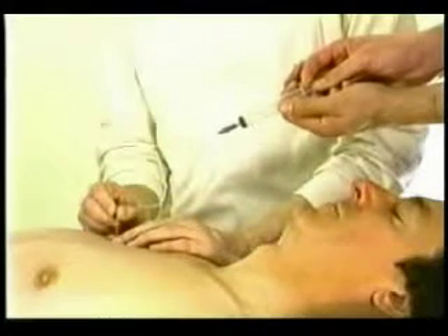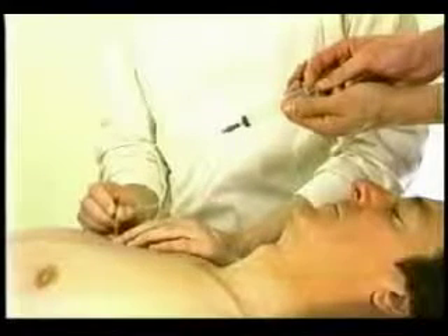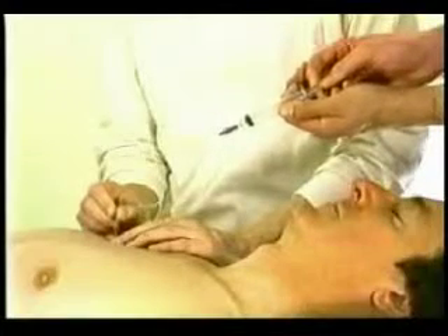In order to get the advantages of both techniques, one can attach tubing and a syringe to the hand-held needle and have an assistant apply suction during the sampling.